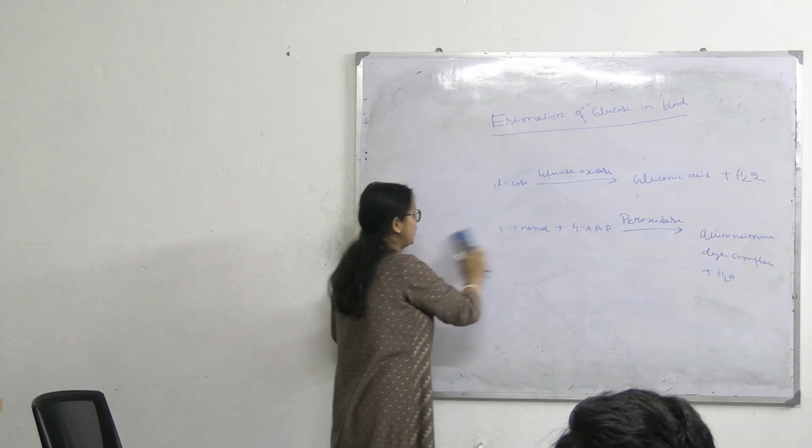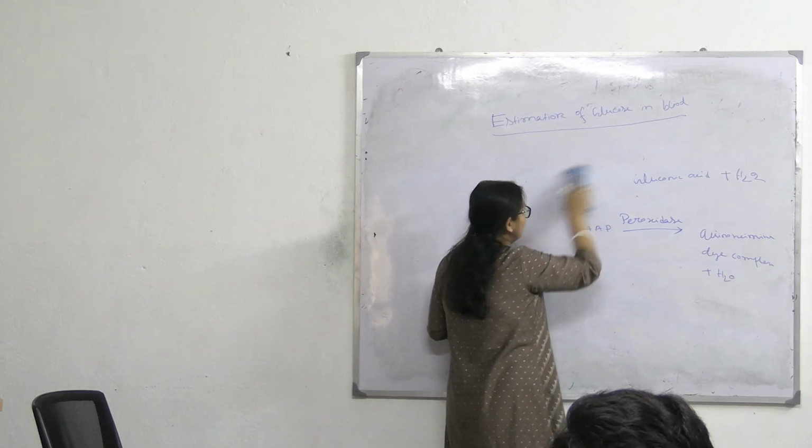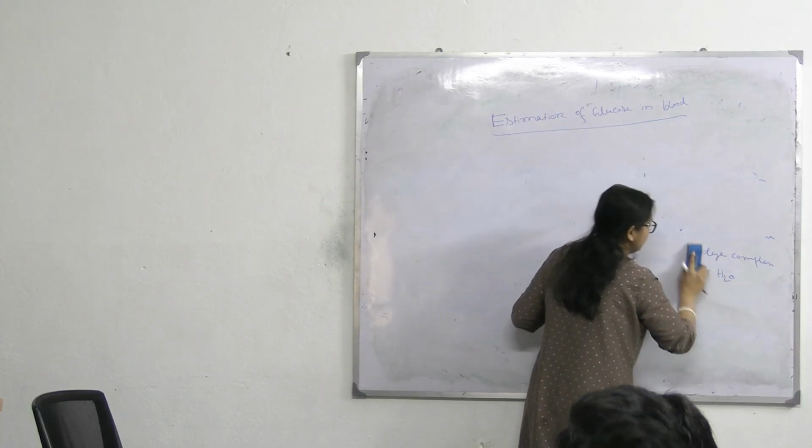তাহলে কি কি লিখলি বল? প্রথমে এম, দেন মেথড, then collection of blood sample, then principle, then reaction.